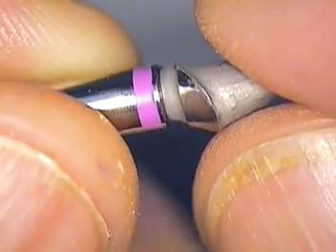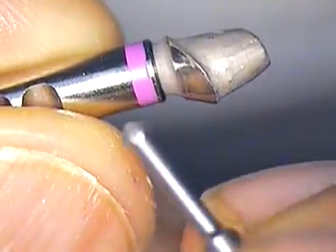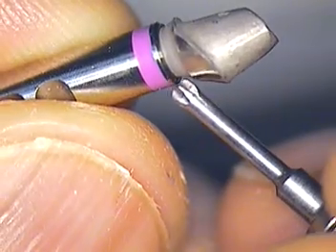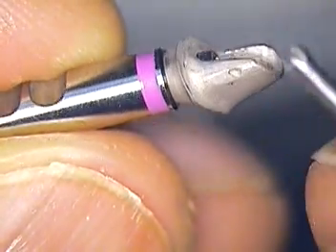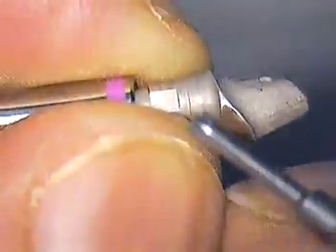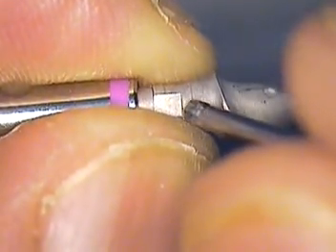From the level of the implant up to the margin, it really should be highly polished. There's another issue here — the lab waxed the case and cast a little lip right here, and this lip is going to be subgingival. You don't want that. You want it to be continuous, so that has to be modified. This collar needs to be polished all the way to the interface between the inside of the implant and this line.